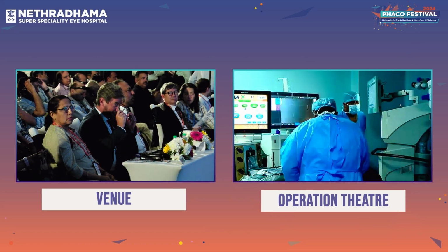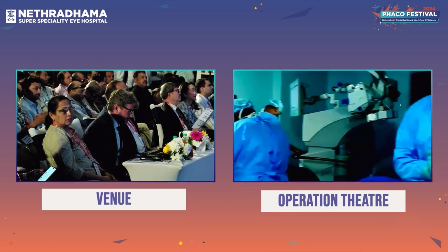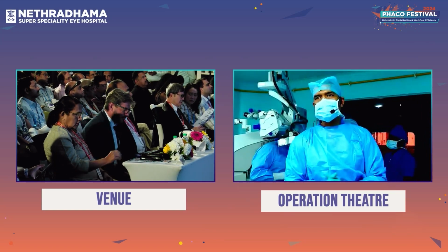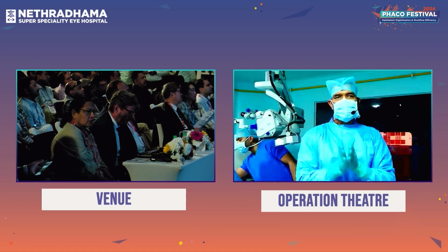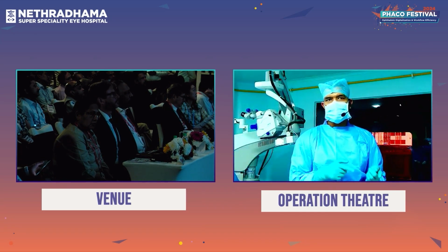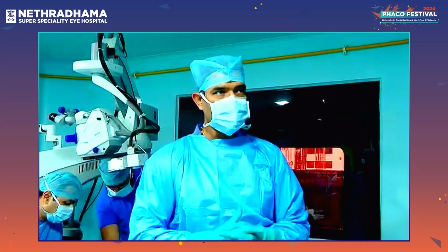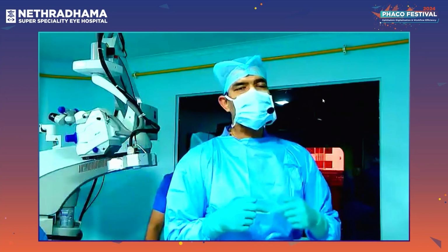So as I was just mentioning, the geometric family, the light distribution that it has is dependent on the pupillary size. So that actually governs which patient should receive what. Now in my practice, if I find the preoperative photopic pupil to be less than 3 millimeters, then geometric plus is a good option, because the geometric has a sweet spot of having 21% light transmitted towards near at 3 millimeters pupillary size. If the pupillary size comes down or goes up, the light distribution for near actually reduces substantially, which doesn't happen with a plus. With a plus, if the pupillary size comes down, the light distribution is more for near.